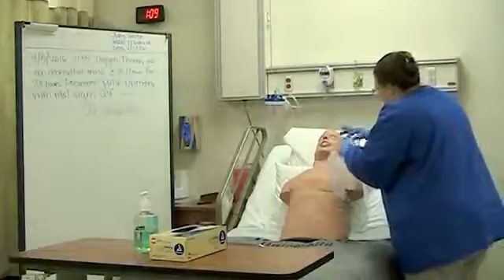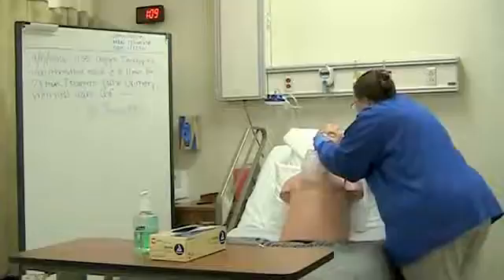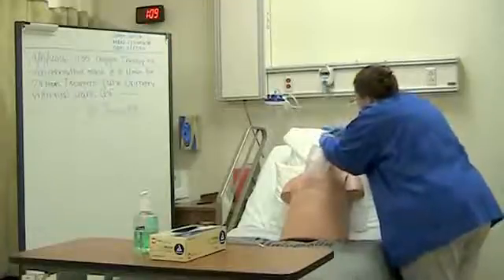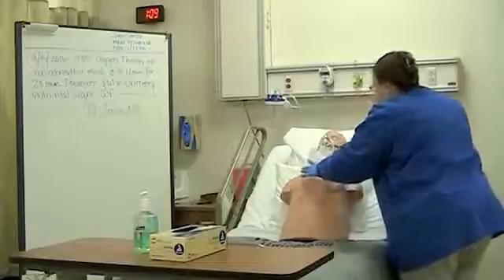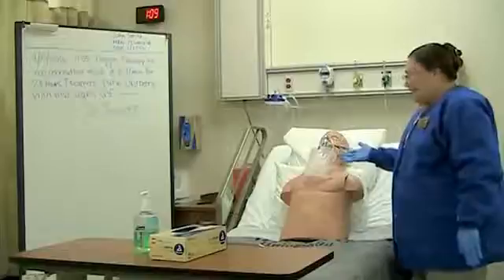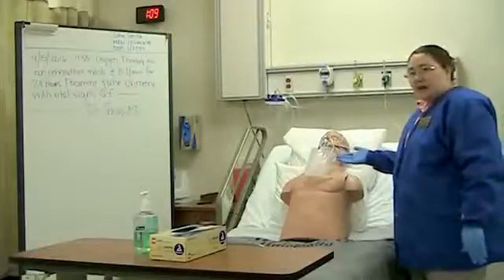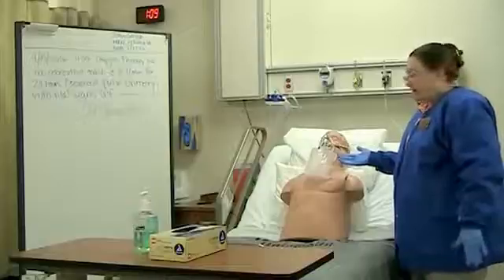Okay, Mr. Smith, I'm just going to go ahead and place the oxygen mask on you. Just going to reach that behind your head a little bit. And going to make sure that it fits well across the bridge of your nose and check the bag. At this point in time, it appears the bag is staying inflated, and I do not need to make any adjustments to the oxygen flow to ensure that we're meeting the patient's needs.